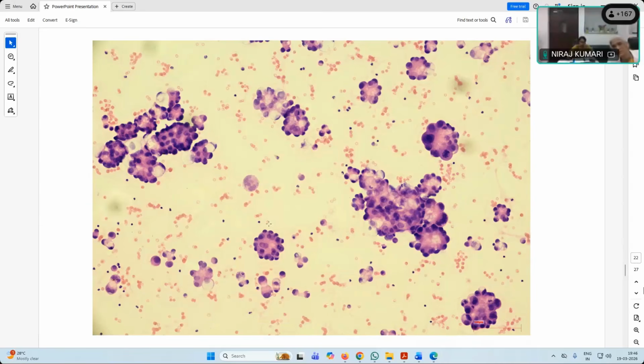What could be the DD here? Is the fluid normal, or what pathology does it have? Adenocarcinoma, diffuse gastric adenocarcinoma. So it is cellular, okay? It is cellular, it has cohesive clusters, which doesn't look mesothelial. It has ball-like clusters, 3D ball-like clusters, cohesive clusters.